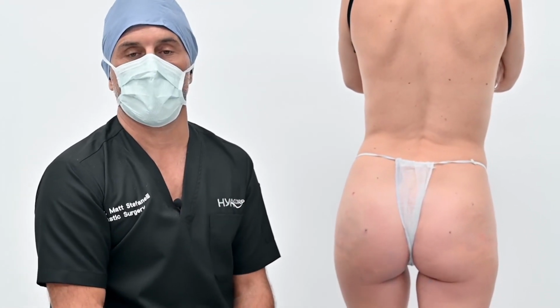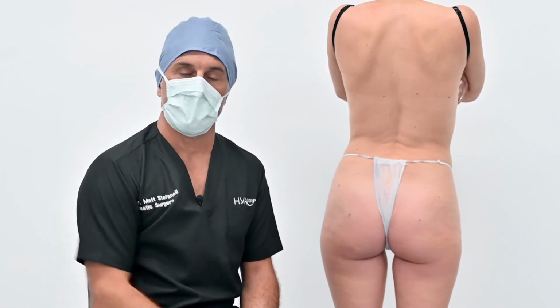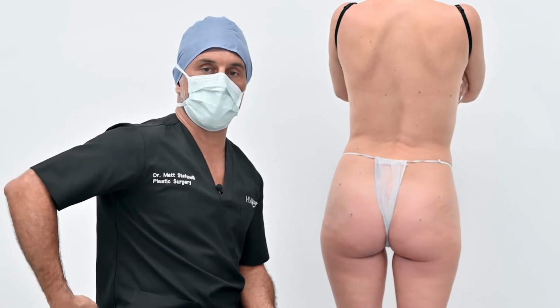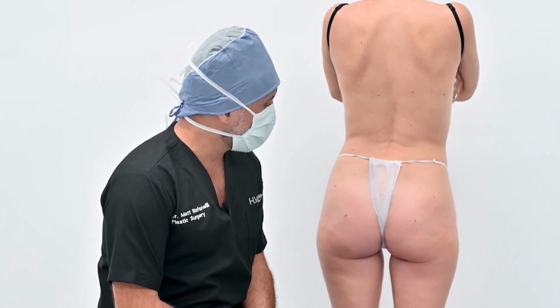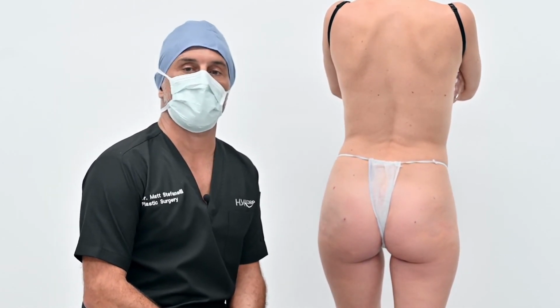And this is really a good way to avoid a bad surprise, after you finish the procedure in a laying down position and the patient says, oh, look at this. It will be disappointing. It will be a little bit too bad not to check before completing the treatment.